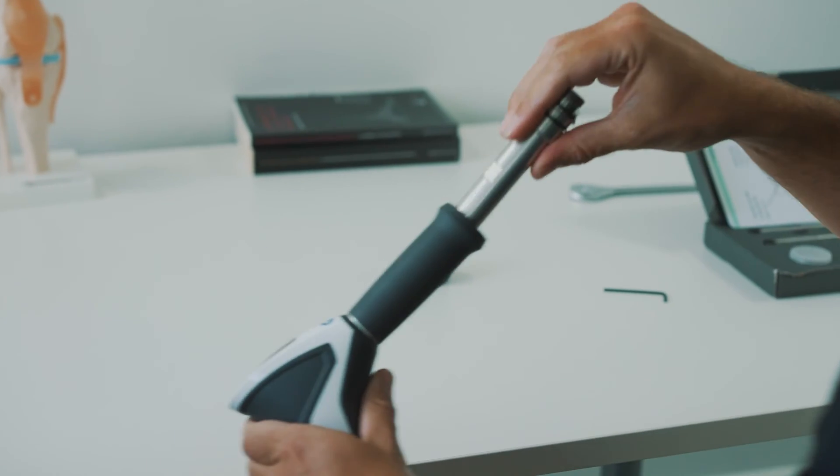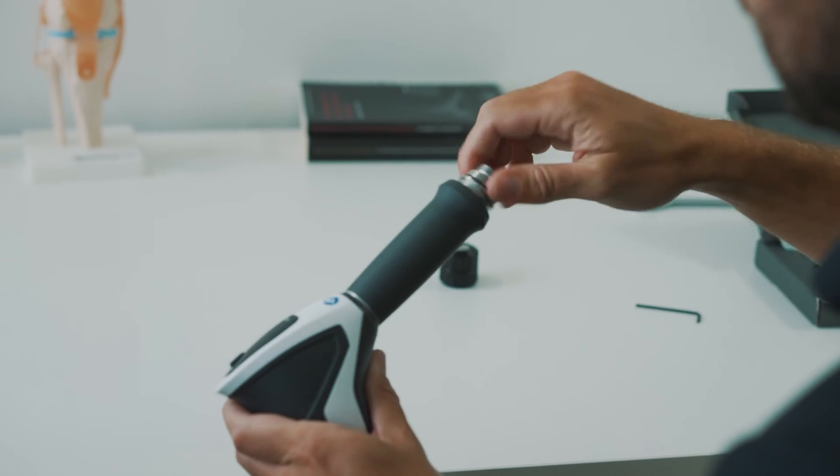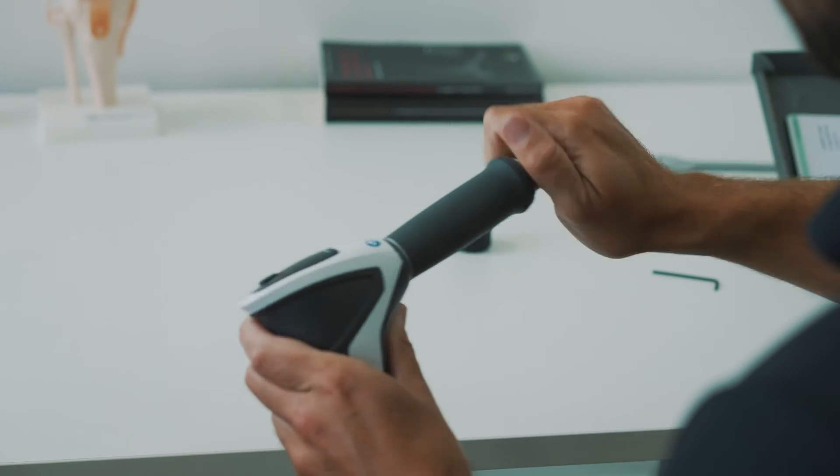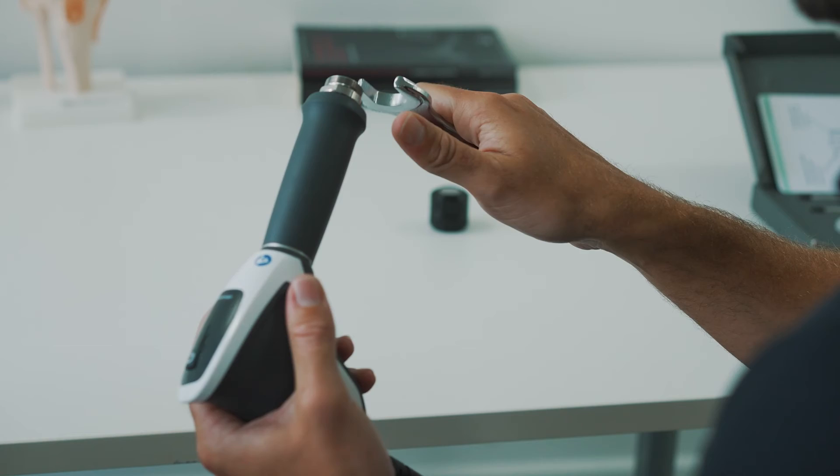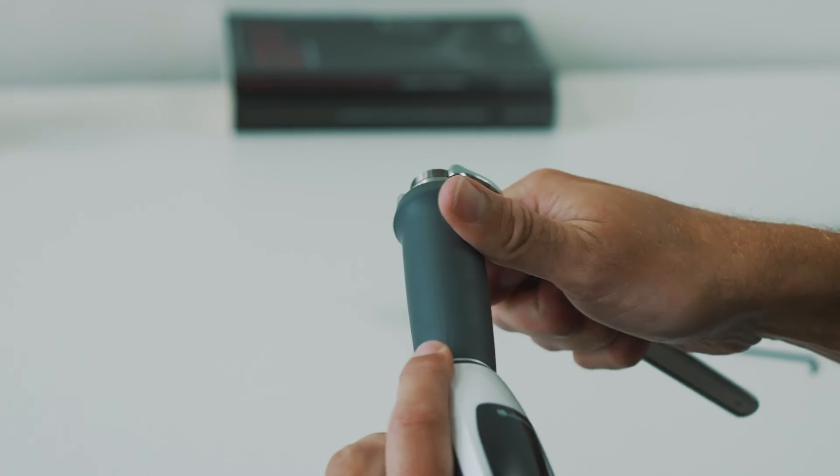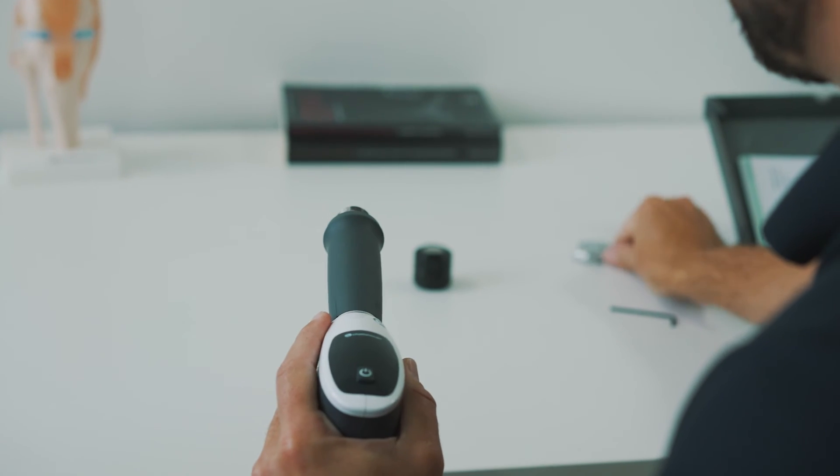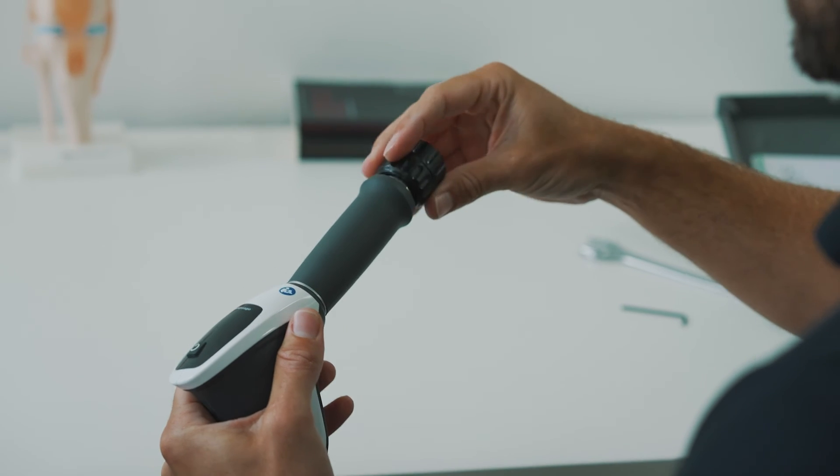Once you've done this, you can reattach the barrel to the handpiece and then use the spanner to tightly secure. Reattach the transmitter.